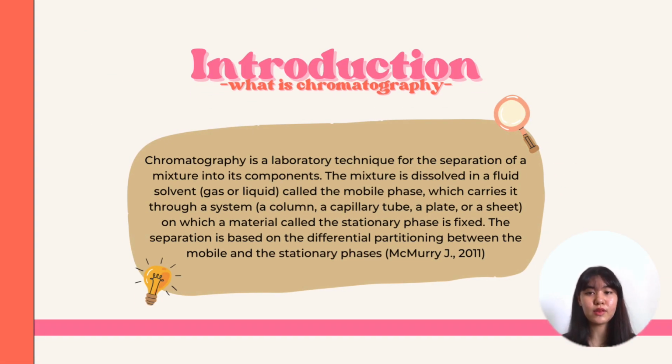What is chromatography? Chromatography is a laboratory technique for the separation of a mixture into its components. The mixture is dissolved in a fluid solvent. It can be a gas or liquid called the mobile phase, which carries it through a system such as a column, a capillary tube, a plate, or a sheet, on which a material called the stationary phase is fixed. The separation is based on the differential partitioning between the mobile and the stationary phases.